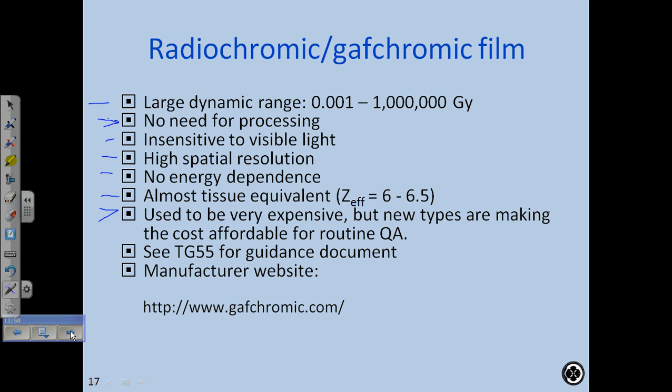And then there's a guidance document, TG55 for radiochromic film. And then the manufacturer has a website. There's tons of information on that website. It's a great website.